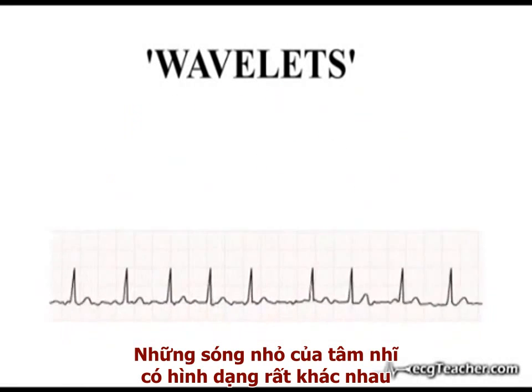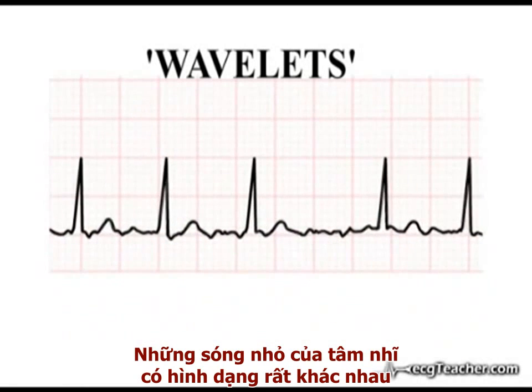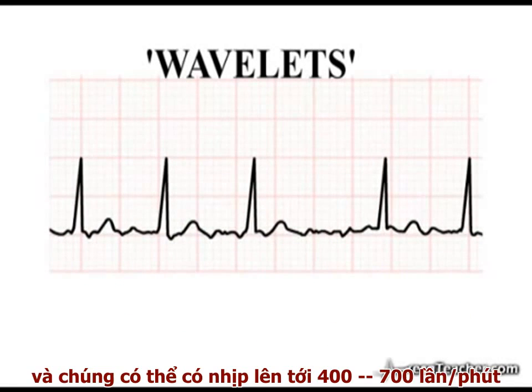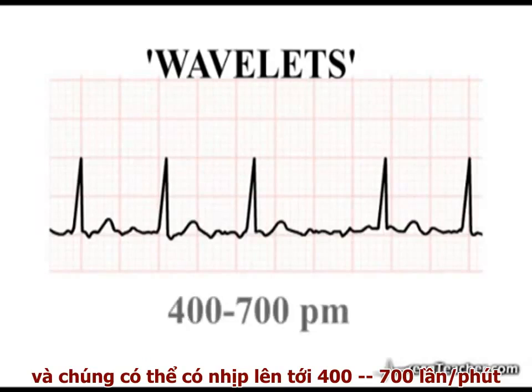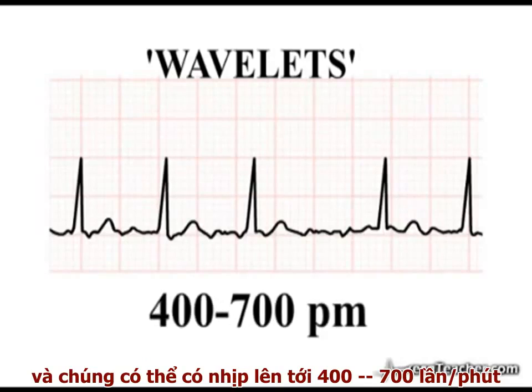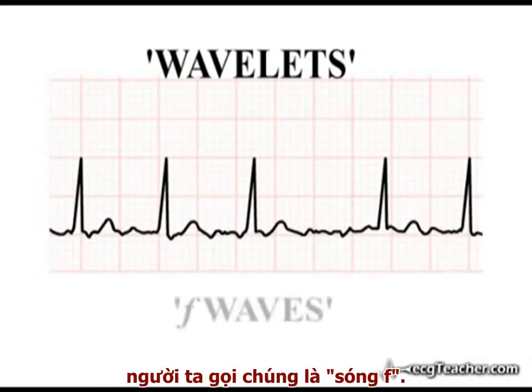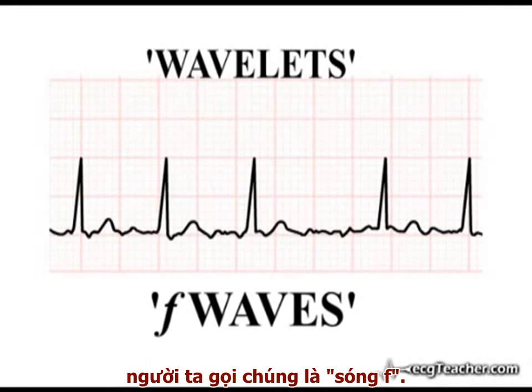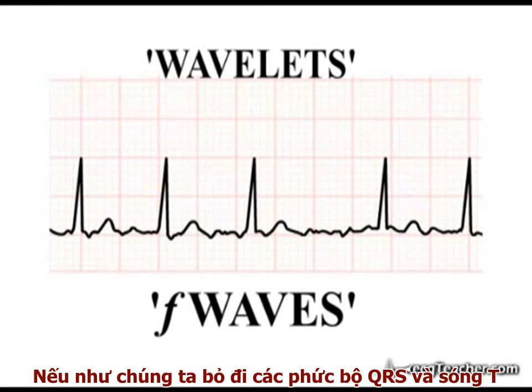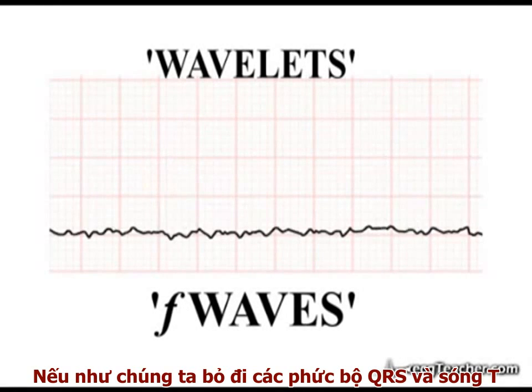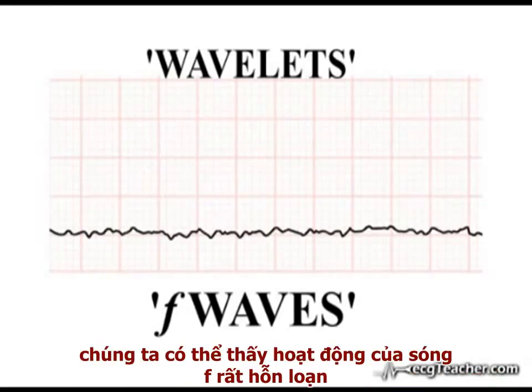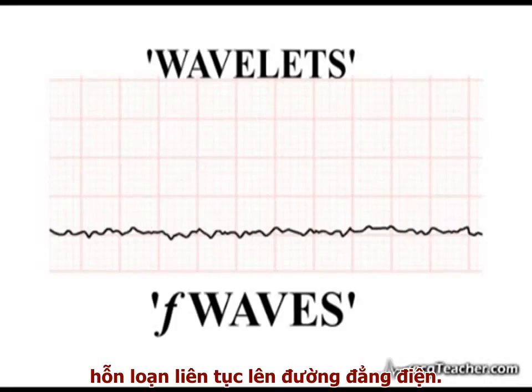Atrial wavelets produce deflections of variable morphology, and these deflections, occurring at a rate between 400 and 700 per minute, are termed F-waves. If we remove the QRS complexes and T-waves, we can see that F-wave activity results in a continuous, chaotic disturbance of the isoelectric line.